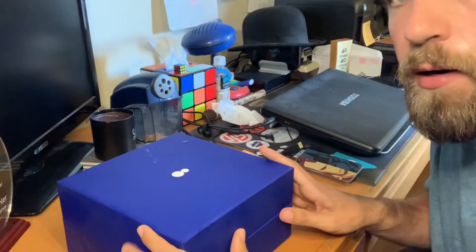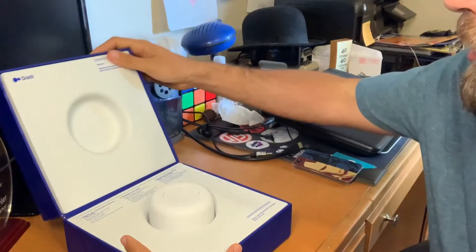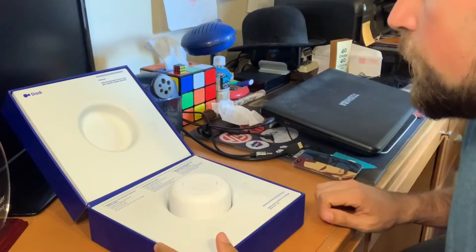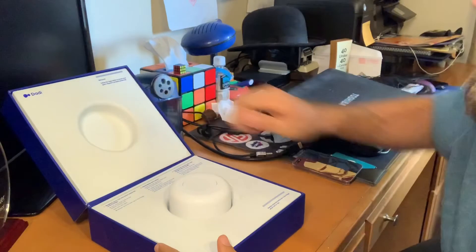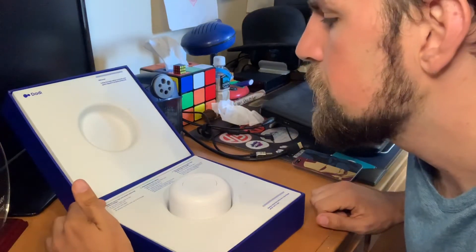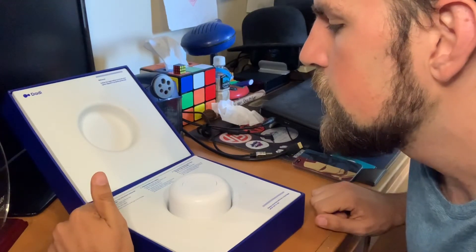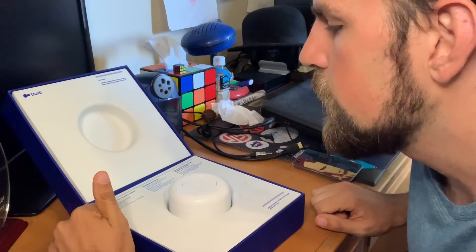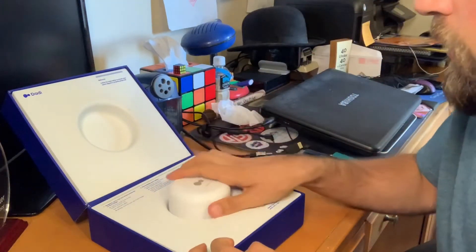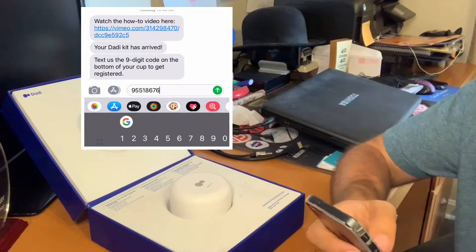We've got our kit here - it needs to sit out for about 20 minutes. While I'm doing that, I'm going to examine the kit. Opening it up, it says: 'Welcome, follow the steps below to ensure your sperm deposit is properly preserved.' It says to register your cup - text the nine-digit code on the bottom of the cup - and always store the kit and cup in the fridge.